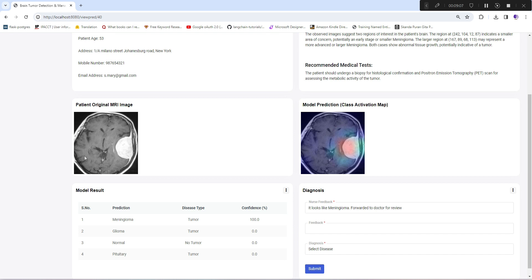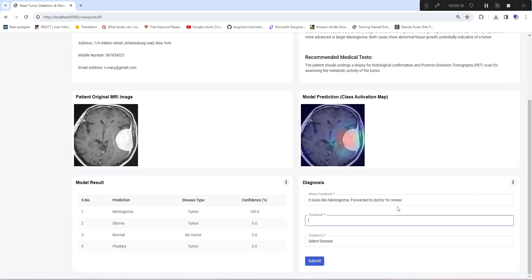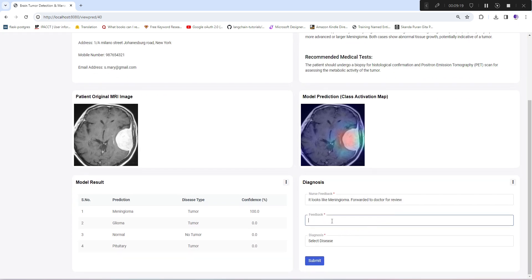You can see patient details, AI diagnosis, recommended medical tests, model prediction, and model results. His feedback and diagnosis are still pending, which he needs to give by analyzing the whole case.